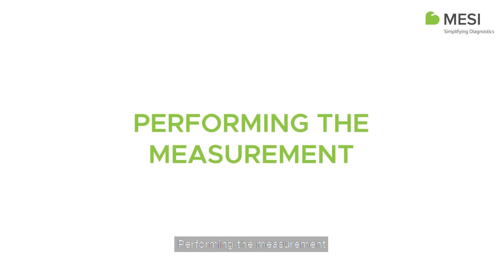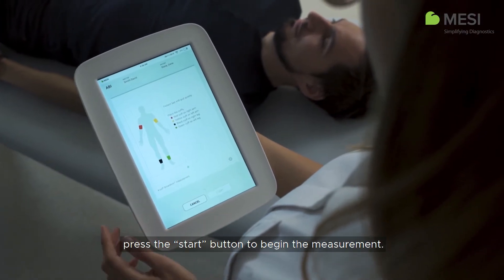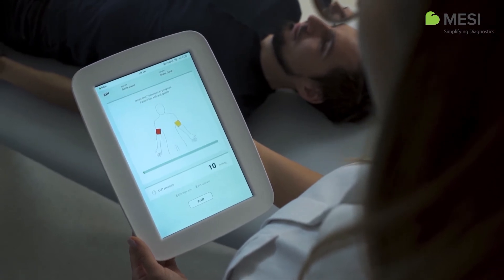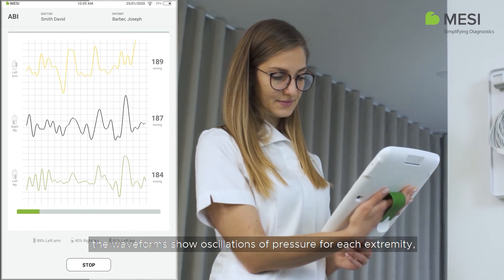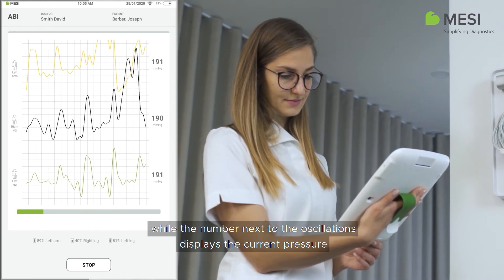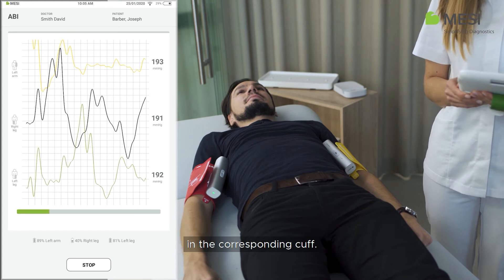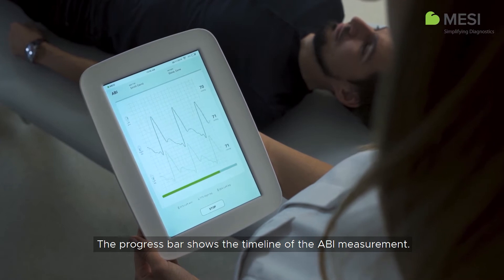Performing the measurement. Once the cuffs are correctly placed, press the start button to begin the measurement. During the measurement, the waveforms show oscillations of pressure for each extremity, while the number next to the oscillations displays the current pressure in the corresponding cuff. The progress bar shows the timeline of the ABI measurement.